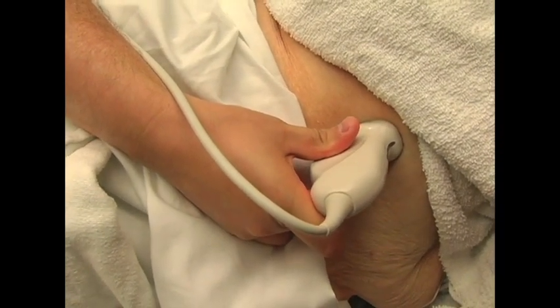Now that Dr. Haggerty is done with the ultrasound on my patient, I know she doesn't have cholecystitis or even cholelithiasis, and I've ruled out gallbladder pathology as an etiology for her pain, without sending her to radiology for an ultrasound. As you can see, ultrasound performed by emergency physicians at the bedside can be a great time saver.